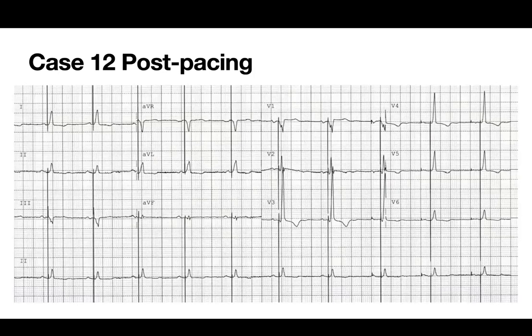Still depend on the injury current and the impedance, certainly. The impedance was about 550. Yeah, you have a little R prime in V1 though. I don't think the first part is the real W that you're going to start with on the right side. You're not on the right side.